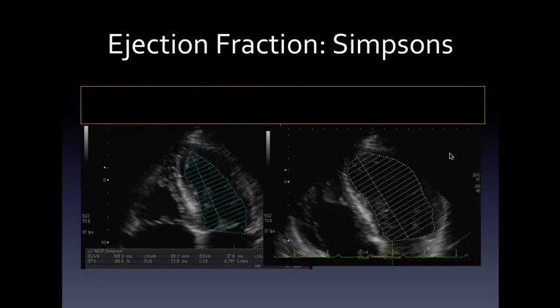You can get very technical and you can readjust the focal point of the ultrasound beam, but you're getting into very technical changes then when you have a lot of other things going on with the sick patient. But it can be done, and sometimes it should be done. And of course, the other thing about it is that because the ultrasound beam is effectively parallel to the lateral wall and the septal wall in this view, it's less accurate for picking up edge definition again as well, because the movement is this way and the ultrasound beam is 90 degrees to it, it's perpendicular to it. So again, it sounds perfect in theory, but in practice these can be very difficult measurements to make.